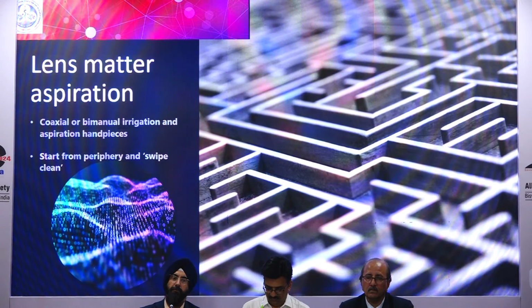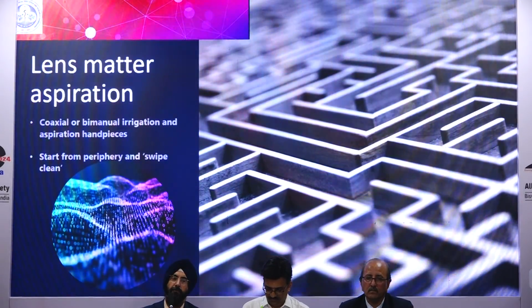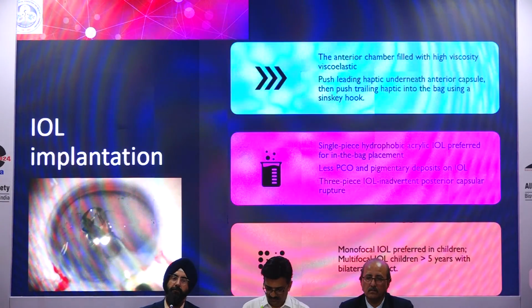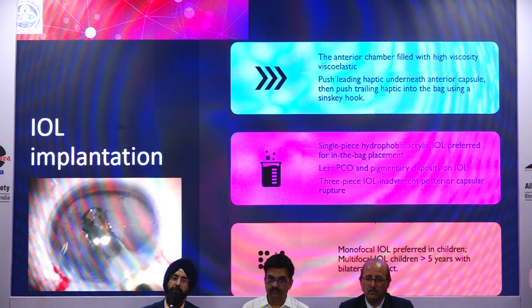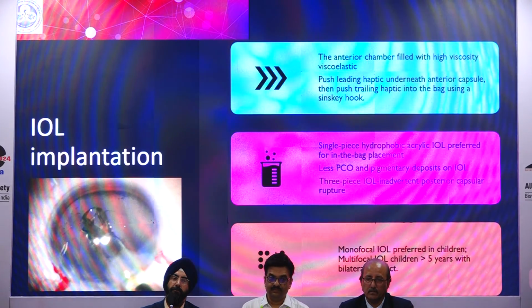Coaxial or bimanual lens matter aspiration can be done. Start from the periphery and swipe clean. For the IOL implantation, the anterior chamber is filled with high viscosity viscoelastic, and push the leading haptic underneath the anterior capsule, then push the trailing haptic into the bag using a Sinskey hook. A single piece hydrophobic acrylic IOL is preferred for in the bag placement. There is less PCO in such IOLs, as well as less pigmentary deposits. 3-piece can also be used in case of an inadvertent PCR.